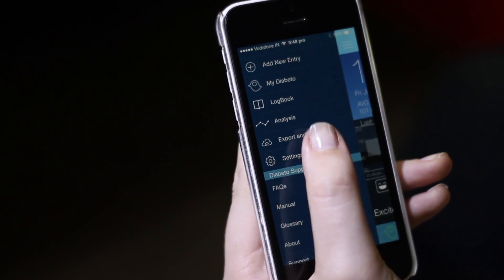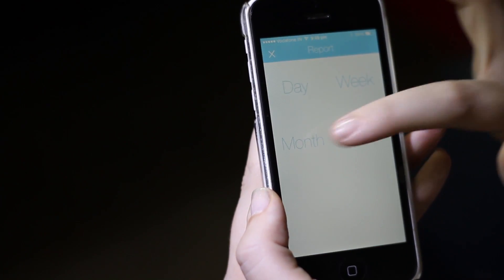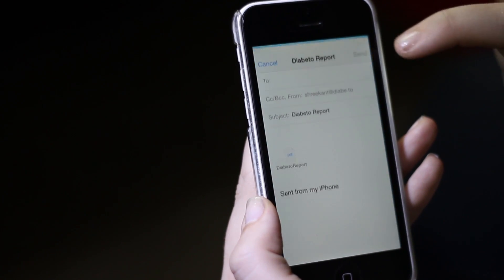Now I'm going to share this data with my doctor by going into the export and share data section for the month, get report, and then I'm going to send this to my doctor.